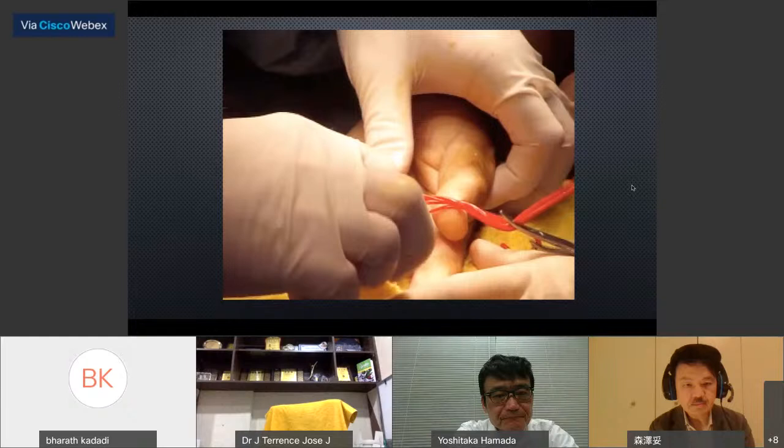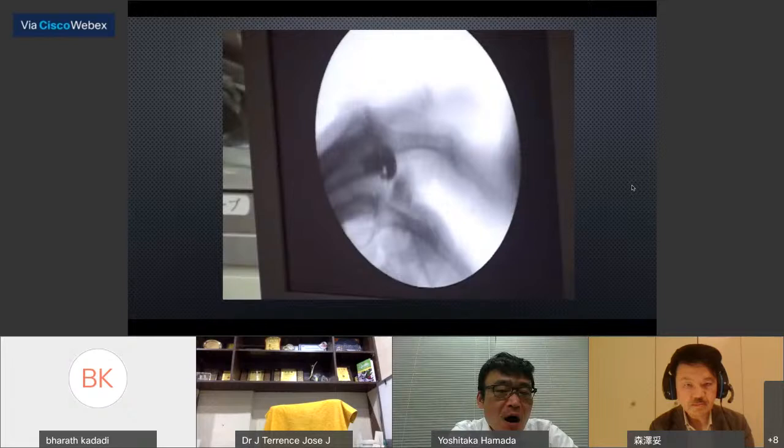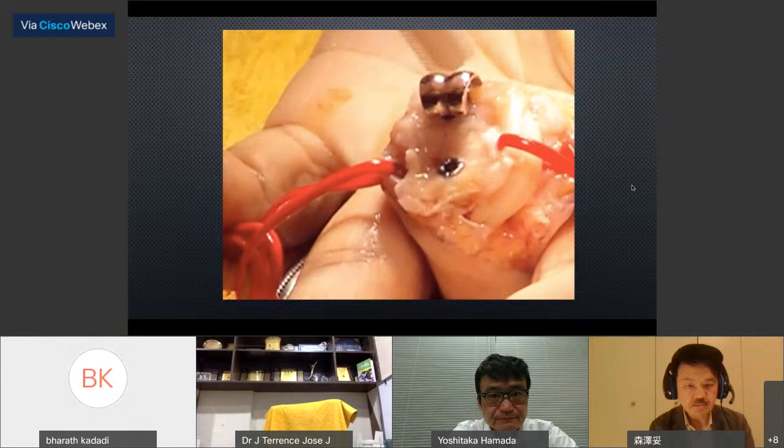While moving the finger, adjust the insertion depth of the joint anchor. If something is tight, reshape the surface of the joint and move the finger again. Check the range of motion, tightness, and stability again and again. When good range of motion and tightness are obtained, the real implant is put on.